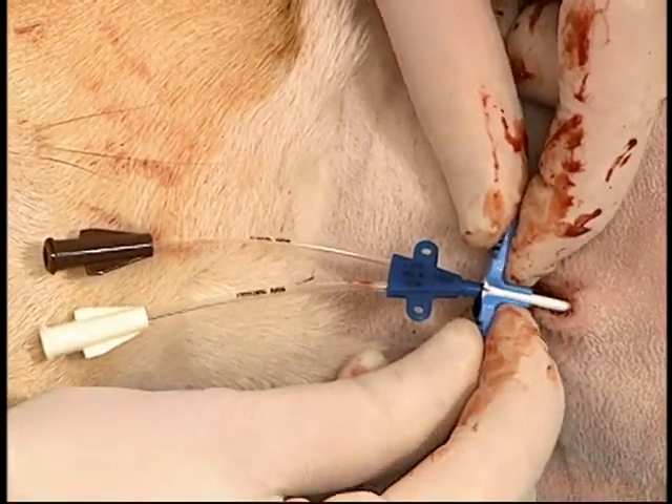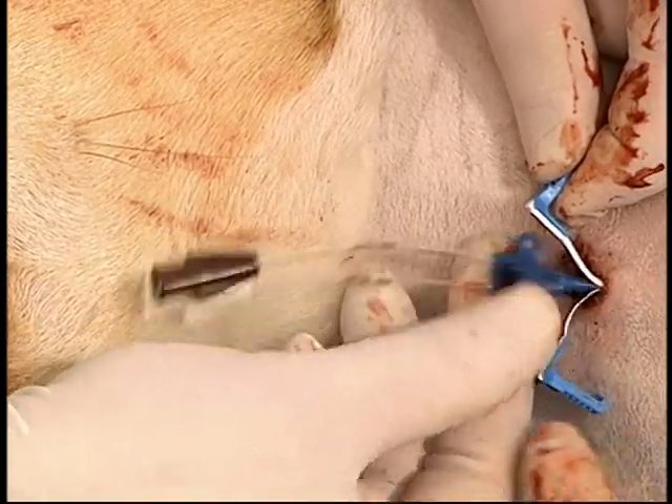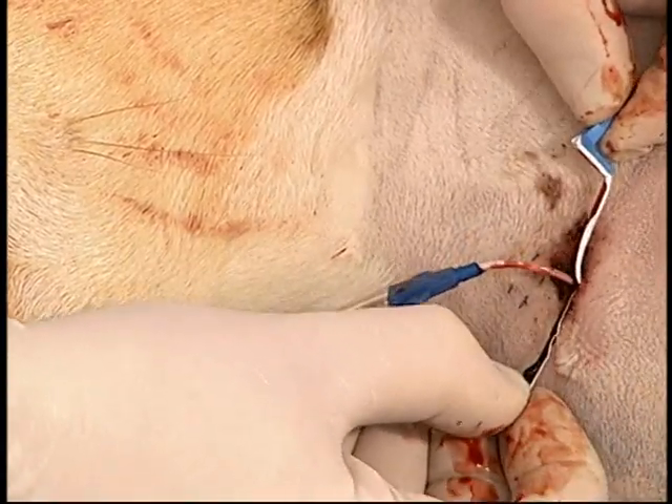Once at that level, the peel-away sheath is snapped off the catheter and gently peeled away while the catheter is simultaneously inserted further into the vessel.